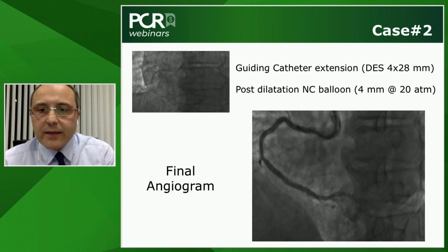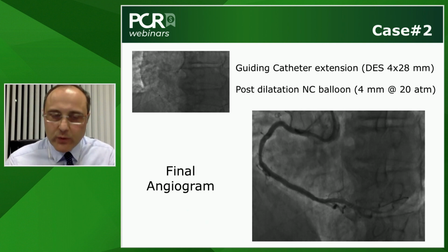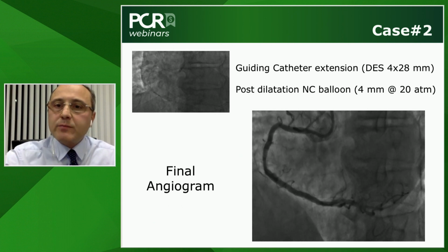Yeah, that's again another very nice case. Thank you very much, Benjamin. We can take the opportunity to address some of the questions. There are colleagues, by the way, experienced in the community who are sharing their feedback with us. They say no issue at all with the second wire, and that's actually the advantage of this technique, that you can always keep your second wire in a side branch.